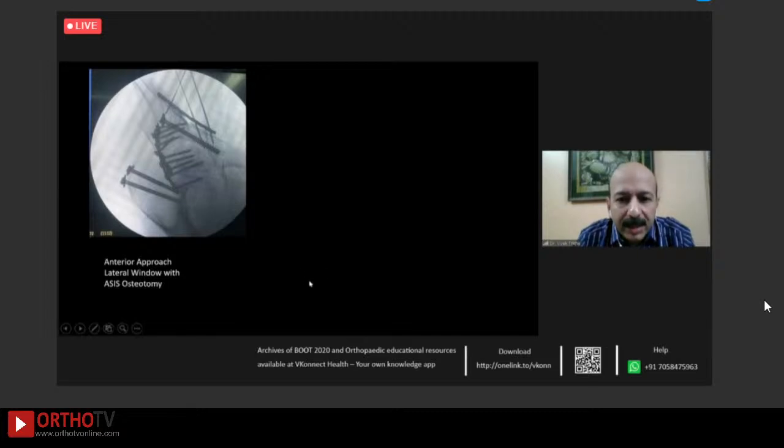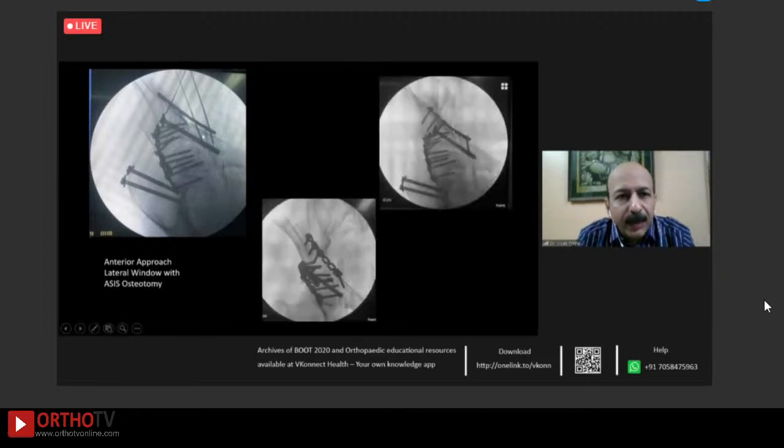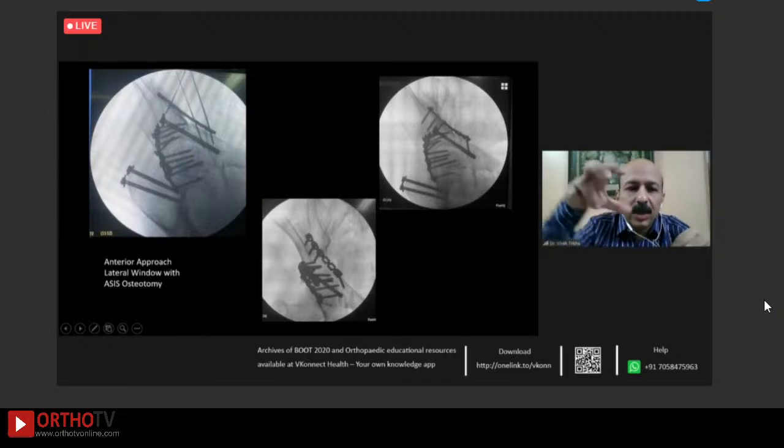What I want to show out here is the beauty that if you want, you can put in your plate so medially, lateral to the iliopectineal eminence and the iliopectineal fascia, with the psoas acting as your cushion against the vessels. If you want, you can put in one or two screws, even medial to the hip joint, and give it stability. If you don't want to put in your anterior-to-posterior screw, I put it here. With that plate, the comminution was properly reduced, the anterior column was reduced, and one screw going even medial to it on the hip joint gives it sort of a bone clamp fixation, which I was able to get.